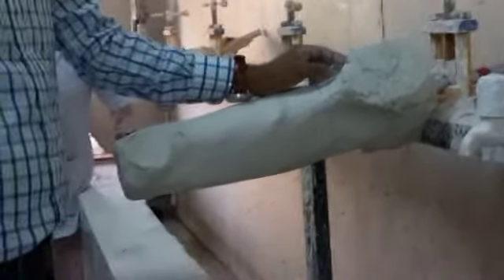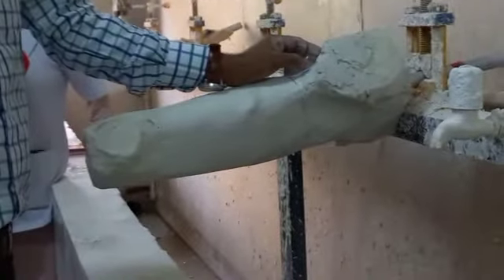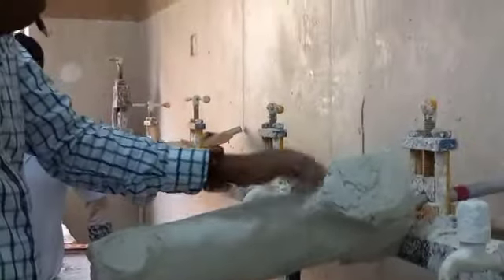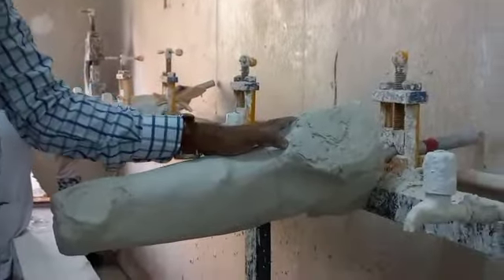Normally what we do, we give some Ethaflex foam in order to make it softer in this area. Otherwise, normally there should be a flexible plastic. If it is a flexible plastic, then you will find that you can cover this area more, right? So normally here it's covering at most 4 centimeter almost. So containment is almost 4 centimeter in the posteromedial side.